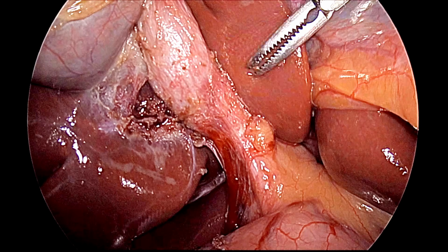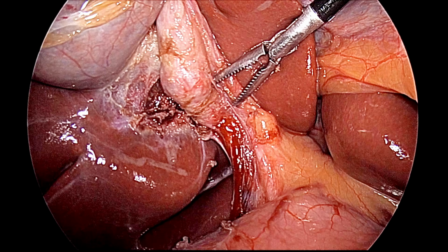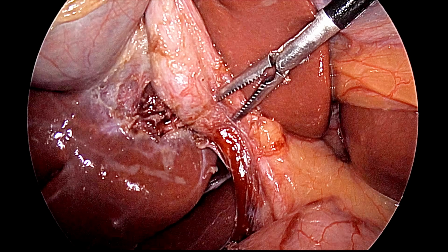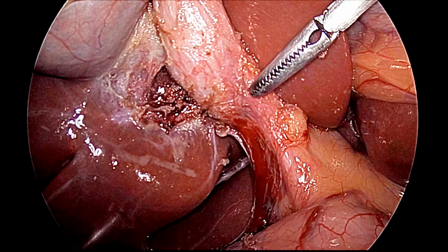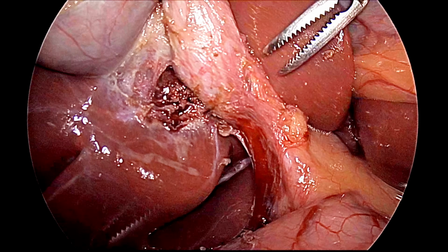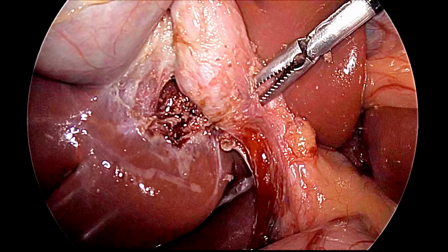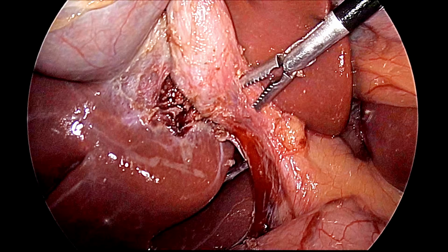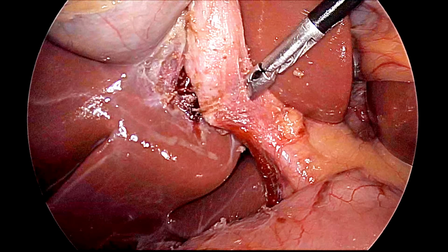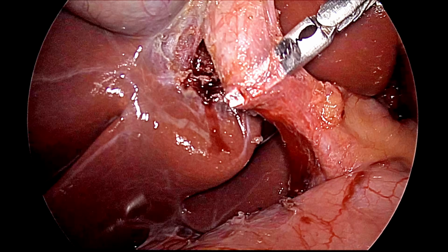Now this is the separation of the cystic duct from the cystic artery, and we can see the lymph node of Lund is visible. Slowly, dissection will be carried out in between the artery and duct with blunt dissection with the Maryland. These are just the fibrous tissue which you can break.